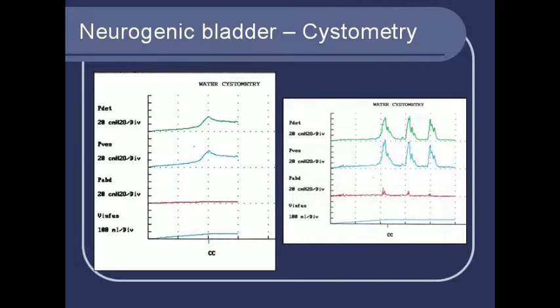I like to project whatever I see on cystometry in my mind's eye as to what the bladder is like. Now this particular child is not a meningomyelocele patient. He is a child with mild mental retardation. He's not quite normal, maybe some sort of cerebral palsy, or some antenatal or immediate postnatal event has happened. Now he came with urinary incontinence, and you see he fills, and then the pressure rises like a void, and he comes down to baseline. Again he fills a little bit, and immediately he voids, and we have to watch him while he is voiding, and you can see a very nice void coming at each of these spikes. It's like an ECG pattern.